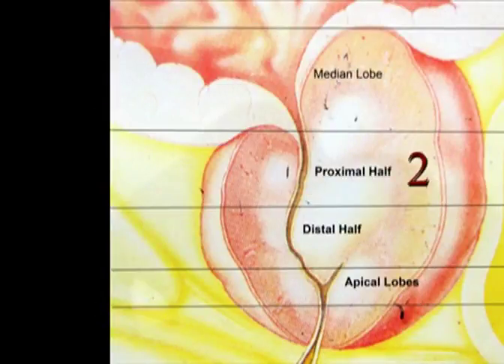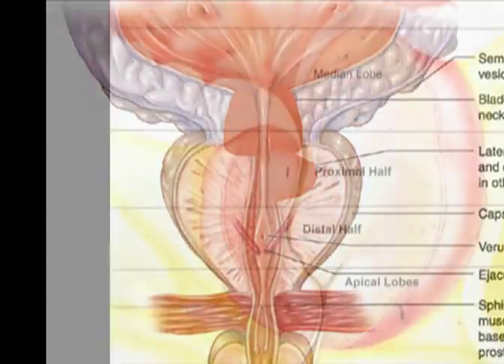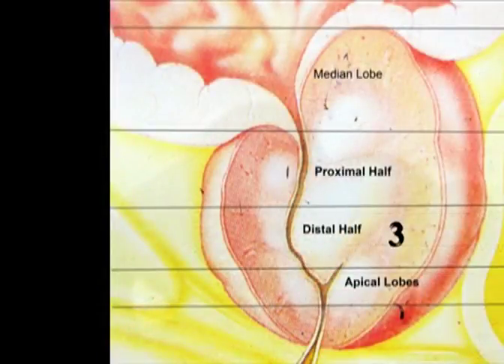After finishing the median lobe, we start by ablating the proximal half of the prostate. The prostate is ablated in layers until the surgical capsule is reached. Then we move to the distal half and the same technique is used.